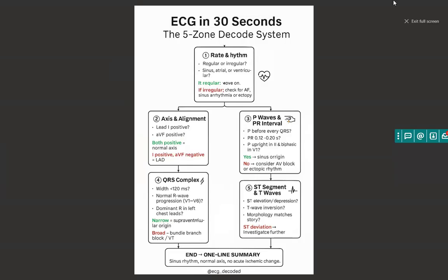For many ECGs, you will know straight away that something is off about the ECG, whether it's the way the T waves have gone, or whether it's the way the ST elevation has occurred. You will know that there's something awfully wrong with the ECG. But in some cases, the changes are there, but you can't make them out. Anyway, for any ECG, especially if the ECG looks normal or looks too perfect to be true, I try to follow this 5-step system.